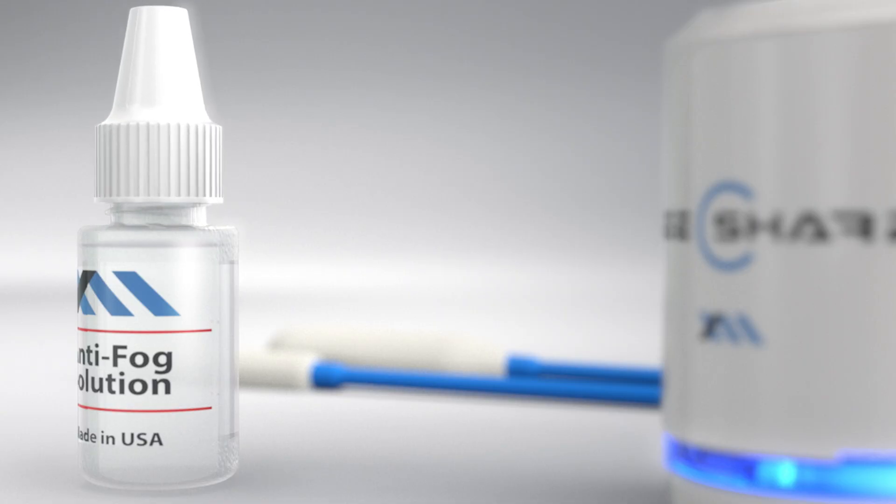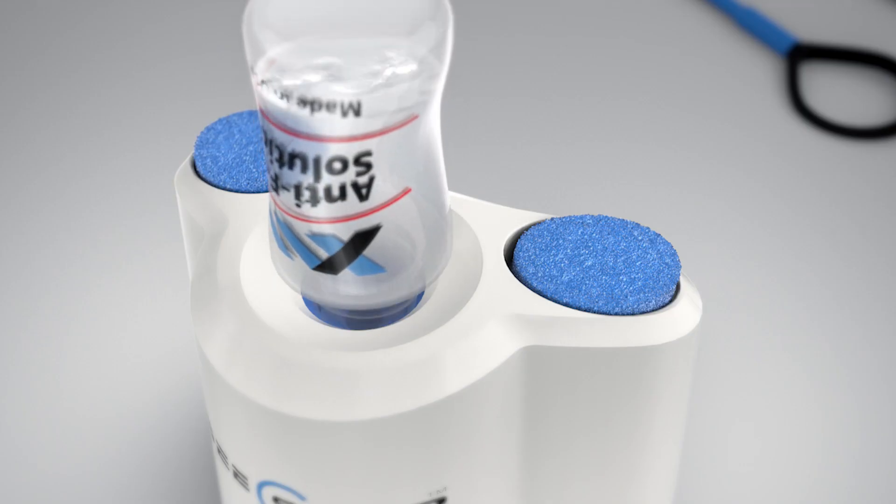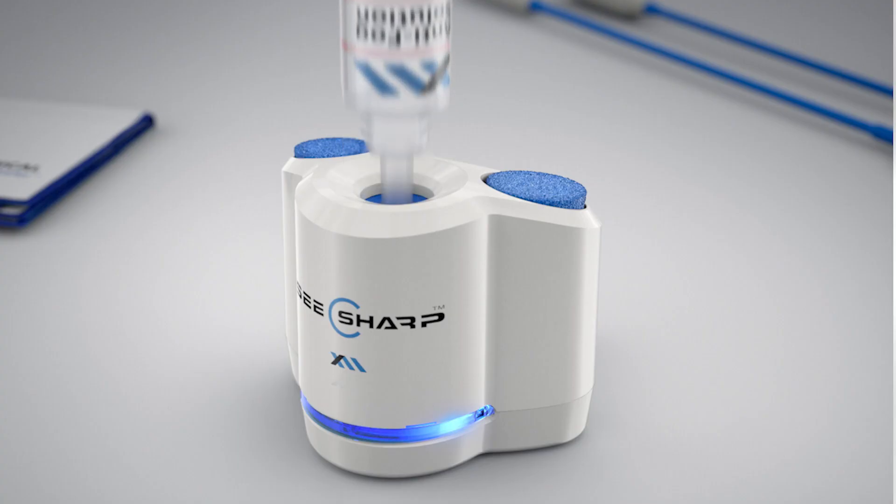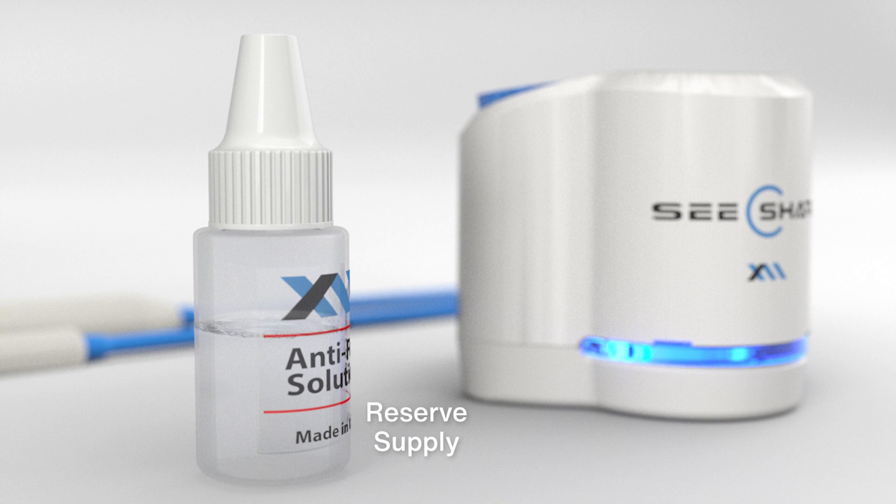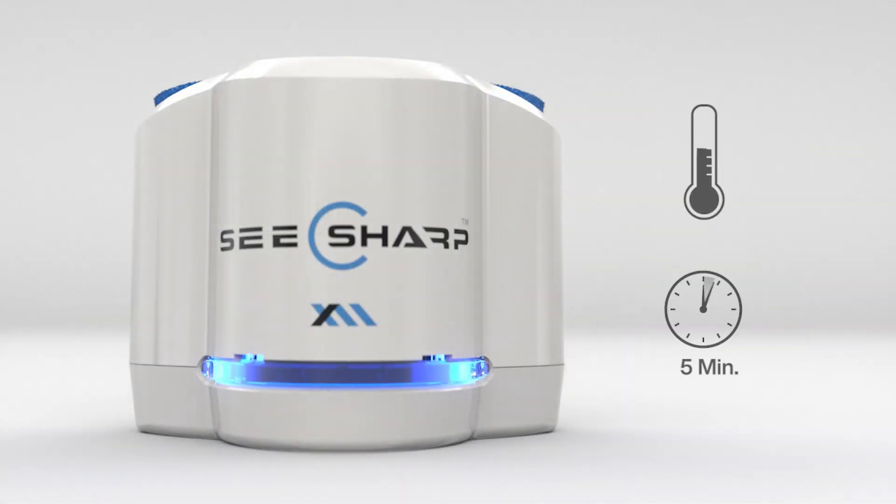Remove the lid from the anti-fog bottle and completely insert the open nib into the See Sharp reservoir. Squeeze the sides of the anti-fog bottle, dispensing approximately one-third of the solution into the See Sharp reservoir, as indicated by the red lines on the bottle's label. Return the lid to the bottle and store the excess solution for potential later use. Allow five minutes for the See Sharp unit to reach optimal temperature.